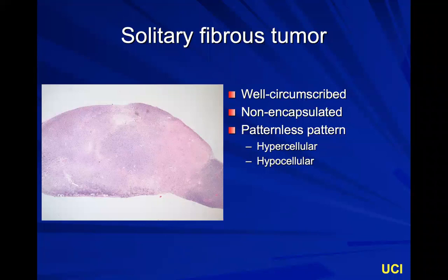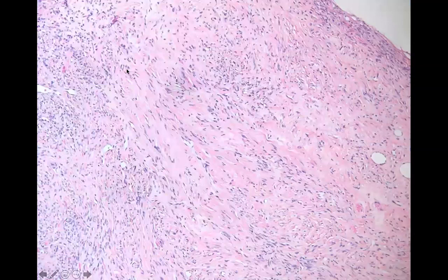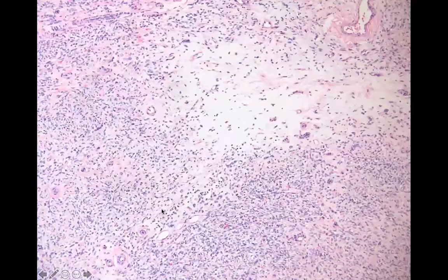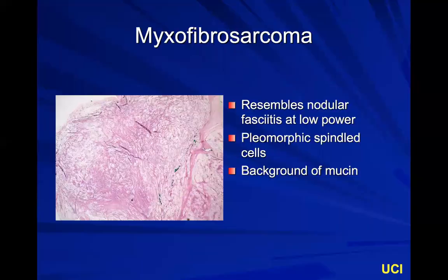A solitary fibrous tumor is a well-circumscribed but not encapsulated proliferation known for its patternless pattern — there's nothing distinct about it except how indistinct it is. You have hypercellular areas, hypocellular areas, very randomly arranged, all composed of spindled cells making collagen. Here's a medium cellular area, a very cellular area, and a hypocellular area — a patternless pattern in a well-circumscribed nugget.